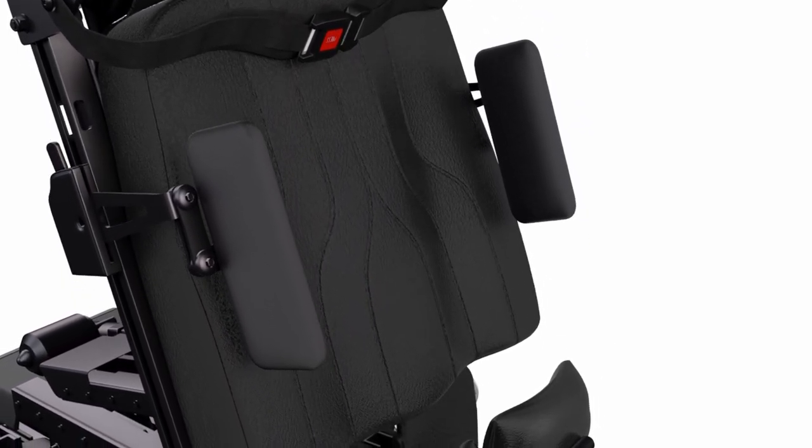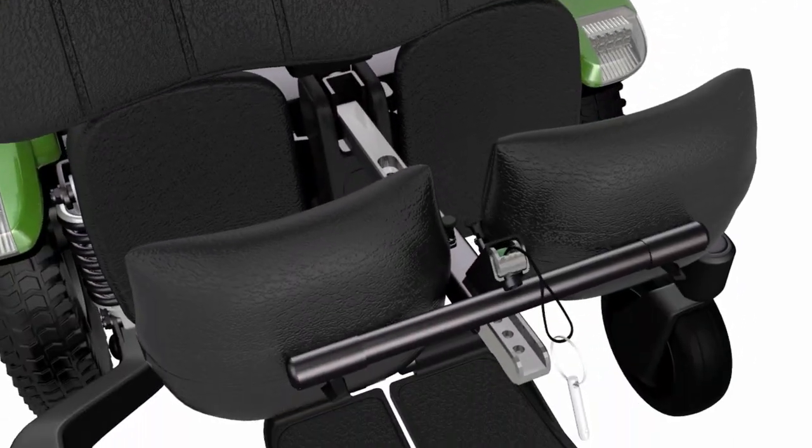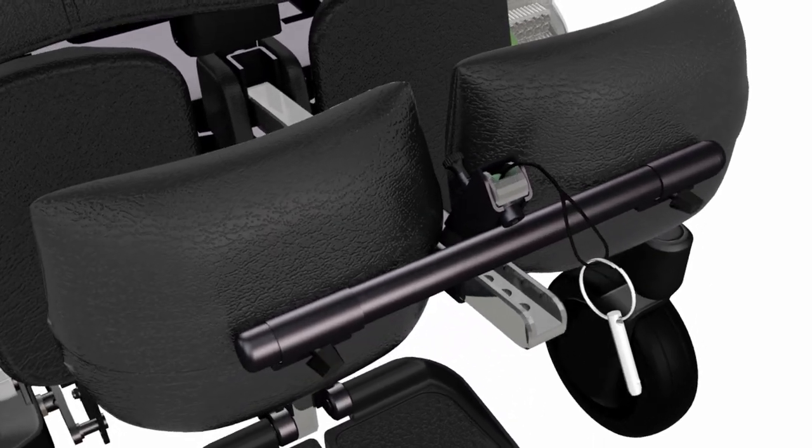Optional hip laterals for additional positioning support easily mount in the Max Ultra Rail. The adjustable knee block offers 2 inches of independent height and depth adjustment.